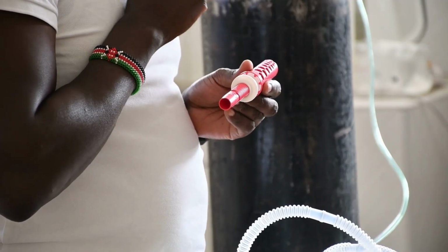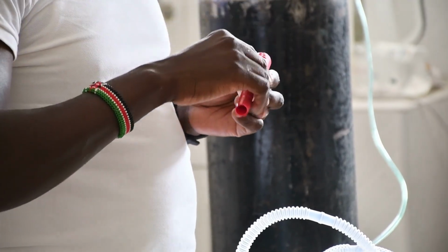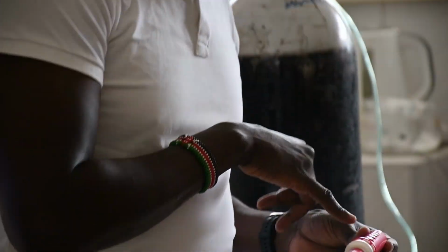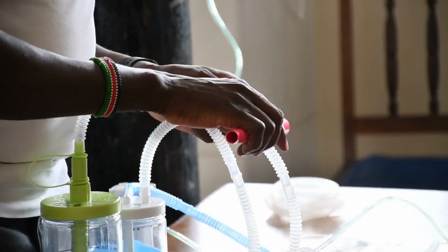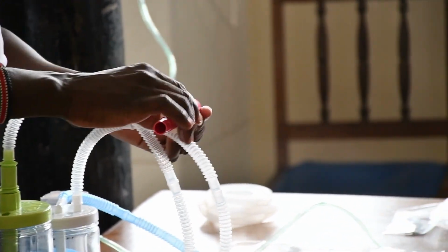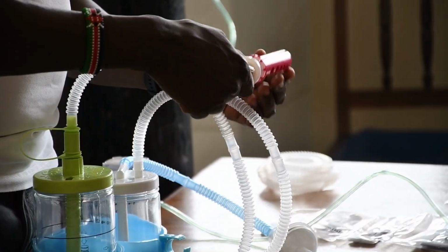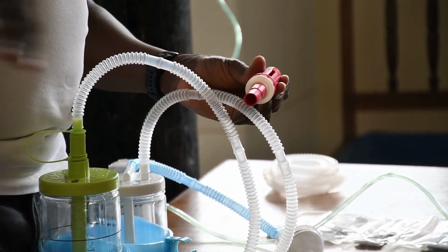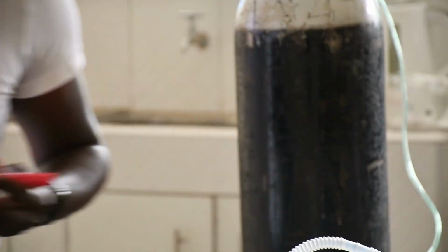If you look inside this blender, there are two nozzles: the receiving nozzle and the exit nozzle. Right now, I've opened the blender all the way out, and you have this oxygen scale here.